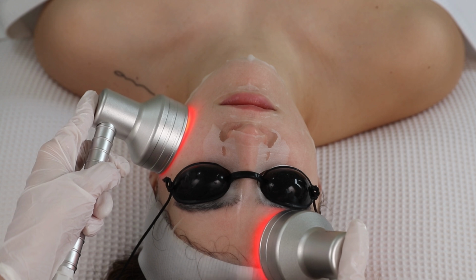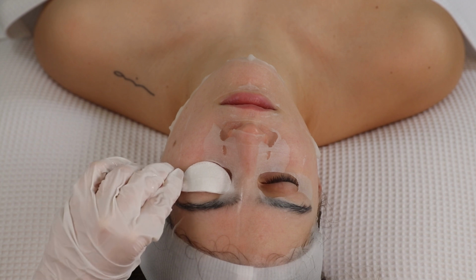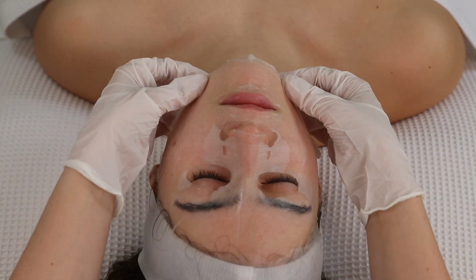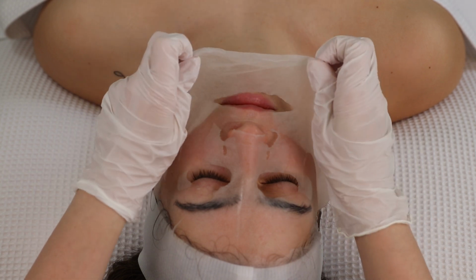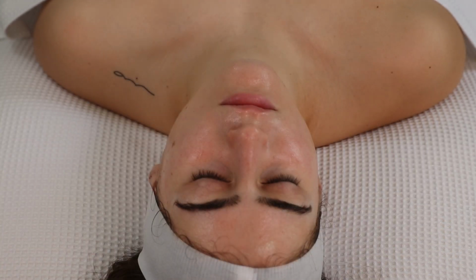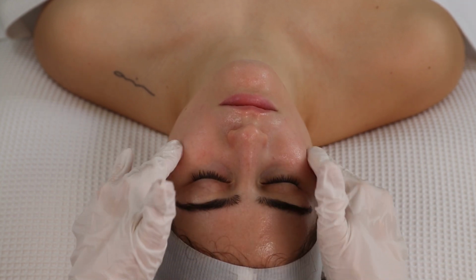Carry out the LED therapy for 5 minutes, and when you are done, gently remove the goggles, cotton pads and sheet mask off the client's face. Using your fingertips, massage any extra solution left on the surface of the skin.